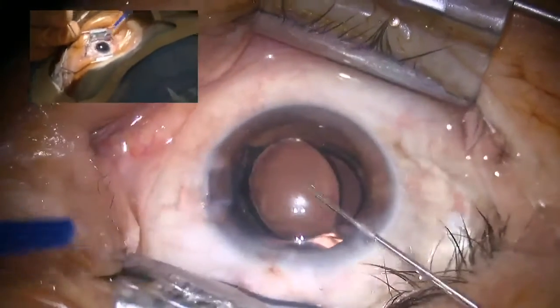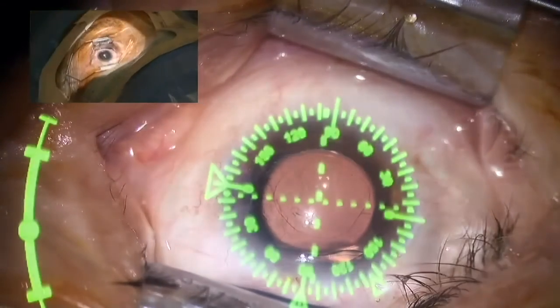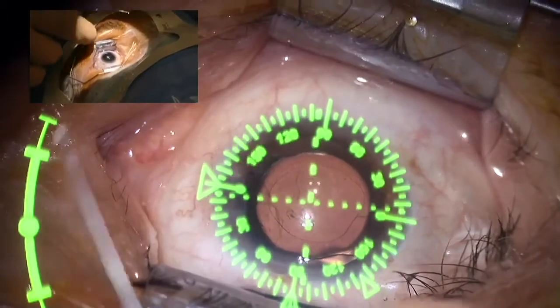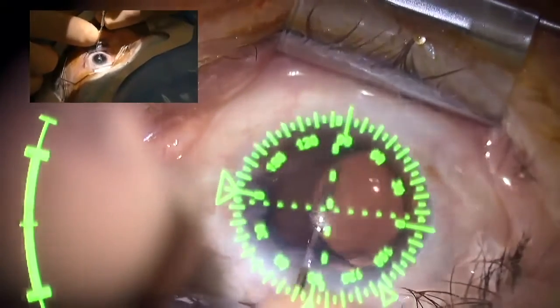It's very easy to implant it. The implantation axis is 94 degrees.